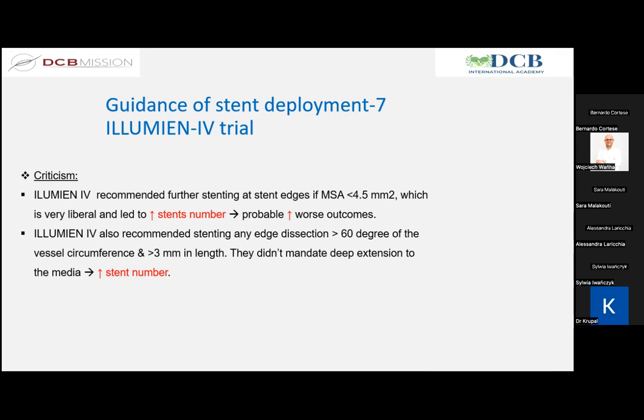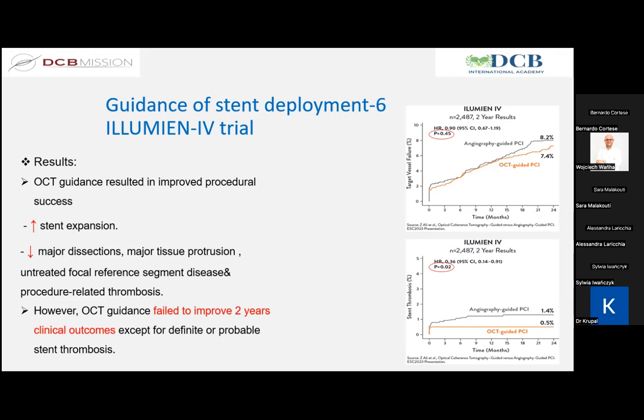But which is your interpretation of the results of this study? I think Silvia, yeah. Wojtek, Alessandra, Sarah, and Krupal, do you have any other comments on this study? Because there were huge expectations from this study, and despite, as expected, the stent expansion being better and procedure-related complications being lower with OCT, anybody was expecting an improvement after 2 years in the clinical outcome, but this did not happen. So how do you interpret this information?